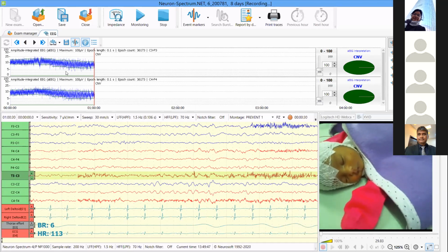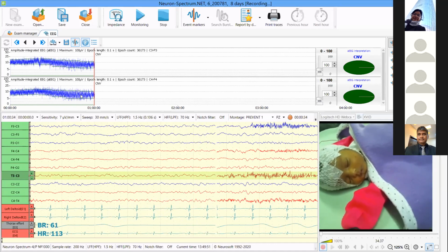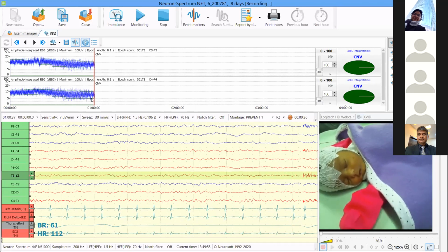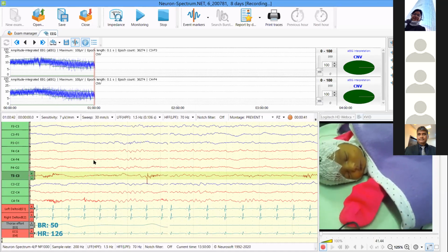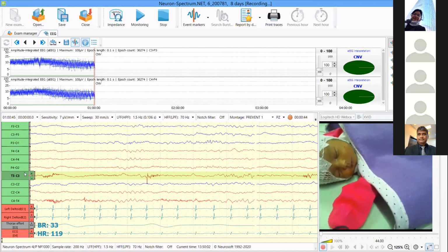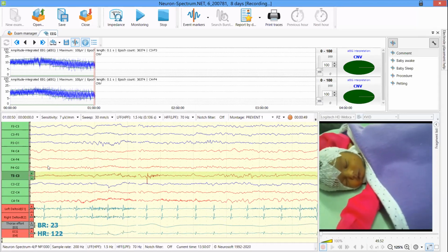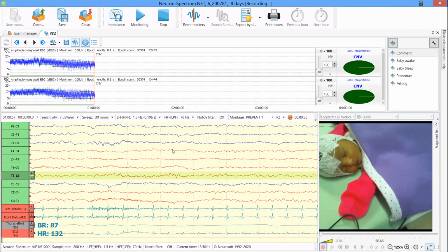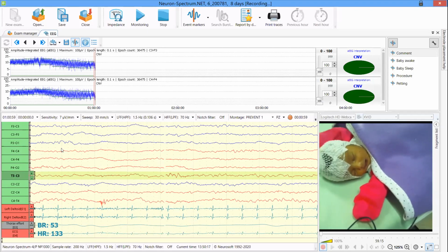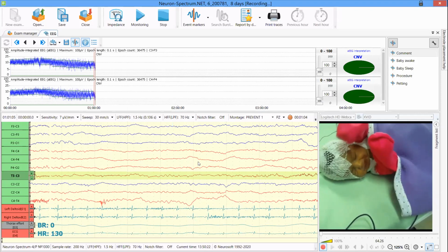So this is what we actually look for, and we also look for any abnormal rise of the aEEG band, which may suggest seizures. You can't see any such bands here. On the lower frame, we can see the raw EEG. We have a reduced montage raw EEG, and this is showing fairly continuous activity, but the amplitude is on the lower side, and the frequency is also a little on the low side.